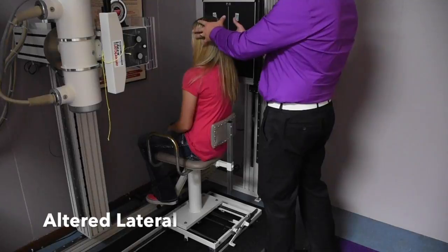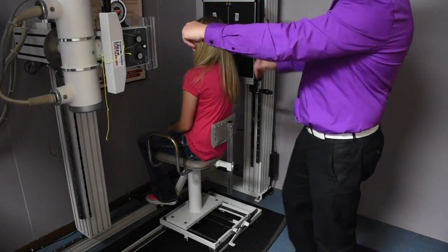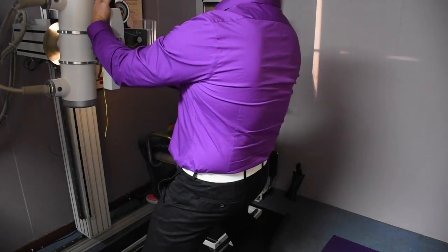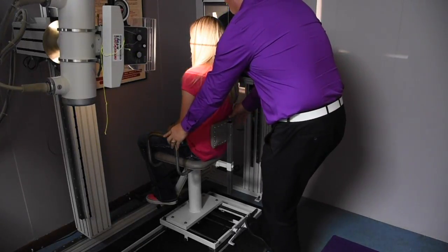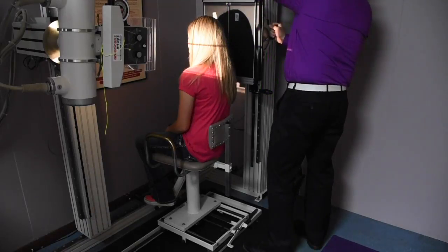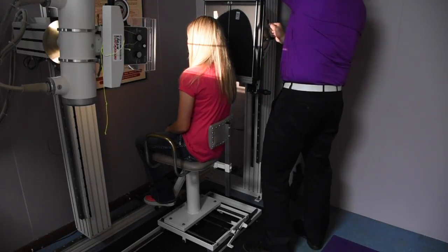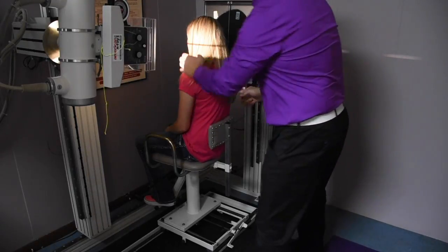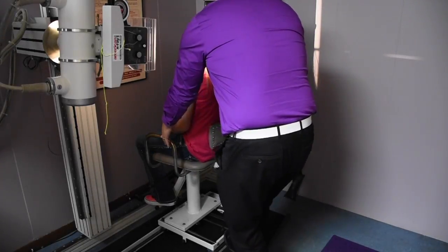Now in this position, the patient has a right head tilt. We're going to tilt the tube to match that head tilt. So it'll be important to be kind of behind the patient, obviously in a level like this. Then what we may have to do is slide the patient slightly to the left, because in this instance we're tilting the bucky to match that tilt.